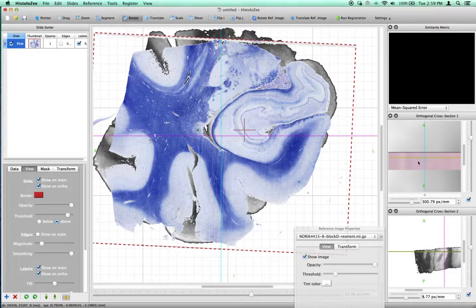By convention, each slide begins at its topmost coordinate. So by clicking on the slide, the crosshairs goes to the topmost coordinate of the slide, and the MRI again jumps to that location.